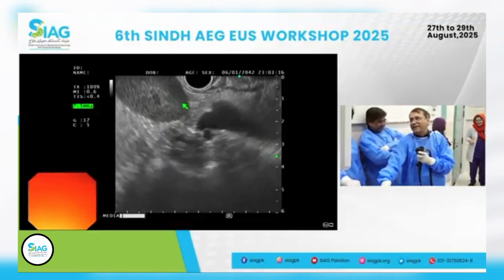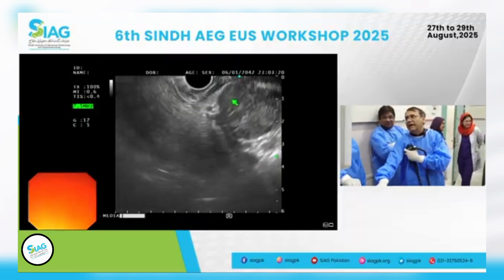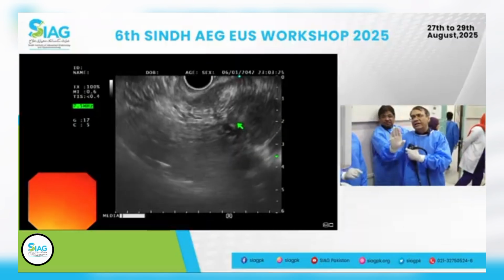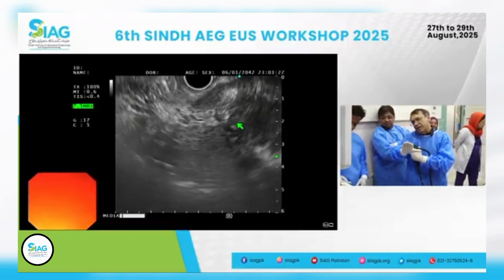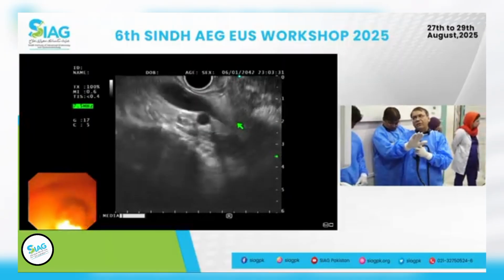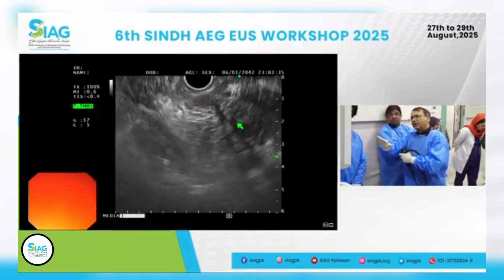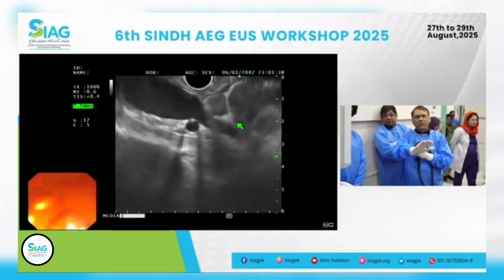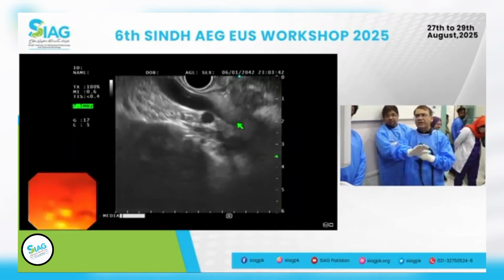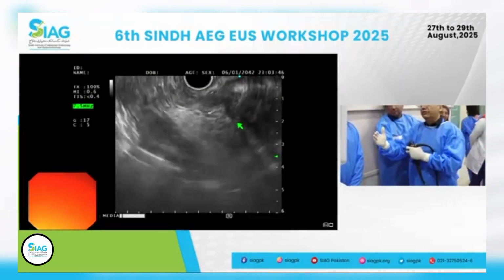Okay. So right kidney, IVC, aorta, head of the pancreas, bile duct, pancreatic duct right there. So I did all that in one position of that transducer. So again, scope is in stable position. Able to do that honestly with one move right here, just doing like that, just with my shoulders and wrist. Back and forth, and scope is in a very stable position.